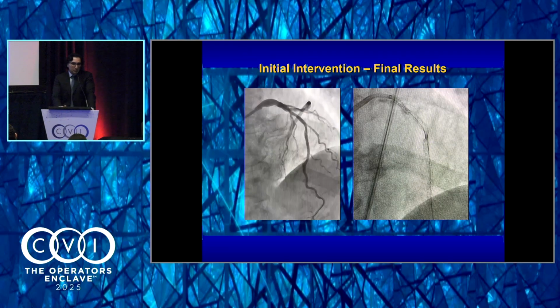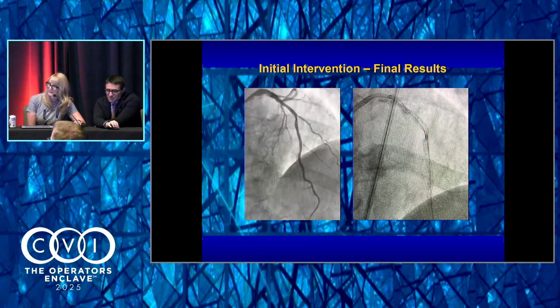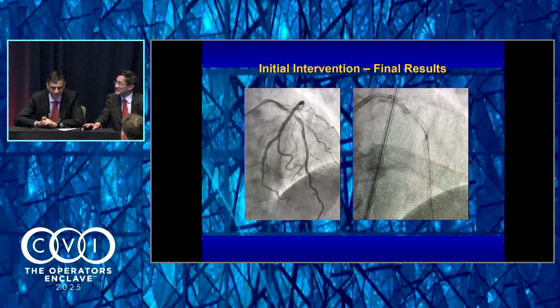So we'll be putting two 2.5 stents in the mid-LAD in a man? I was going to say, no, that doesn't exist. So it's very likely undersized. It's already a great case because you put in 3 layers into a calcified underexpanded lesion. So this will be a good test case.